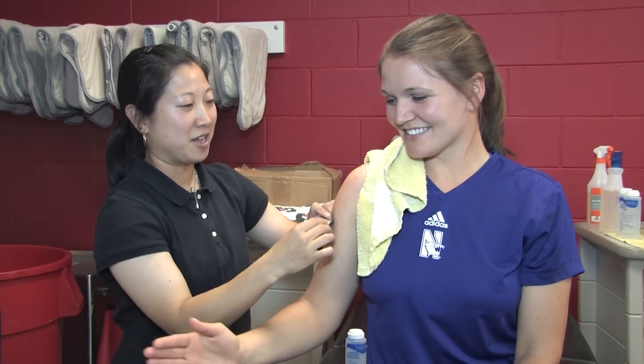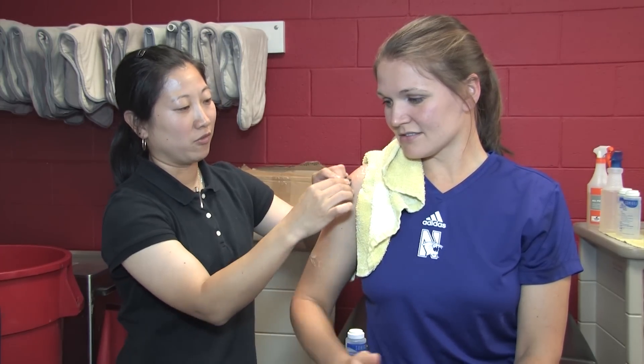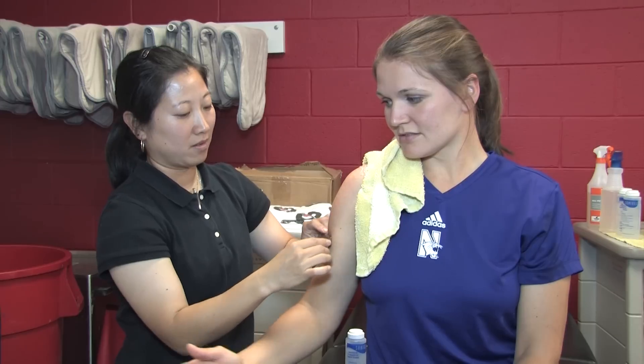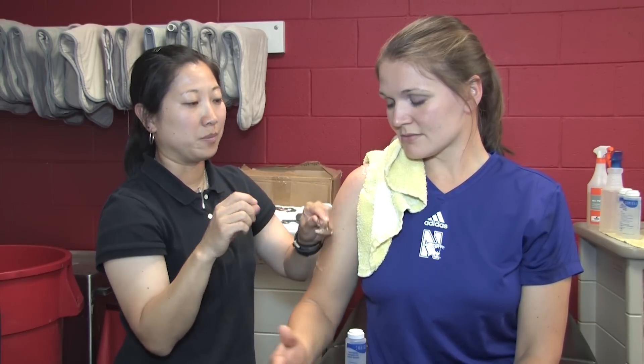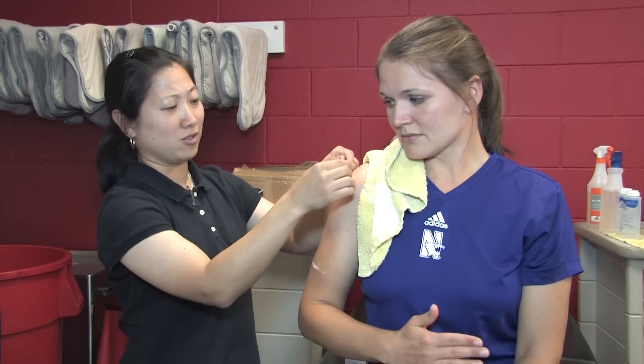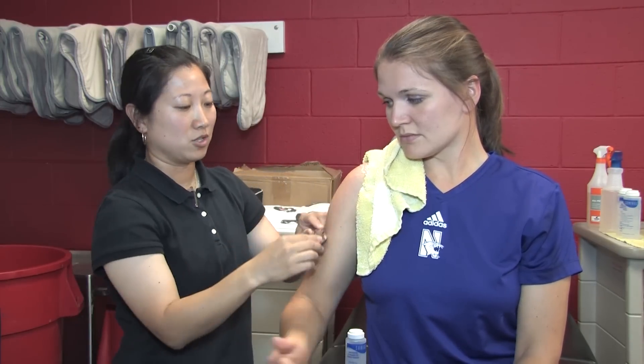I feel like I am not moving as much and the instrument is taking more of the pressure off of my finger. If I were doing trigger points, I would not be as tired. I feel like I could do this all day. I don't have to move or adjust my position — I am not tired as much either.